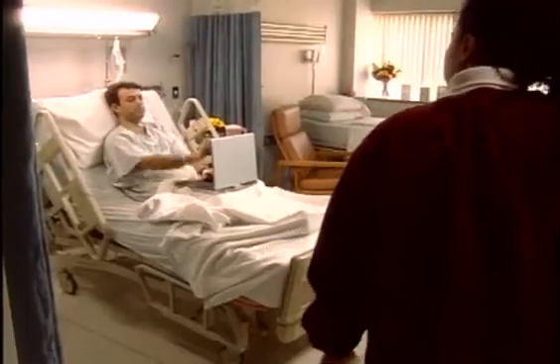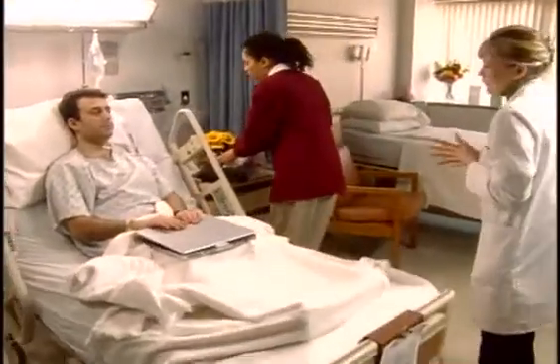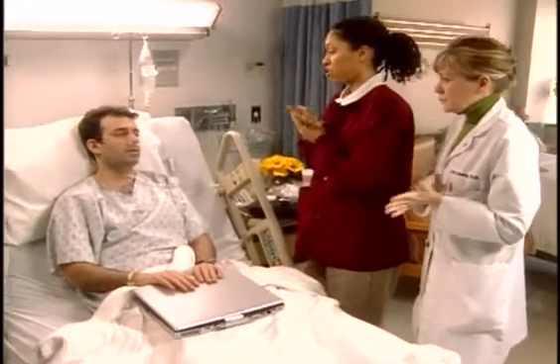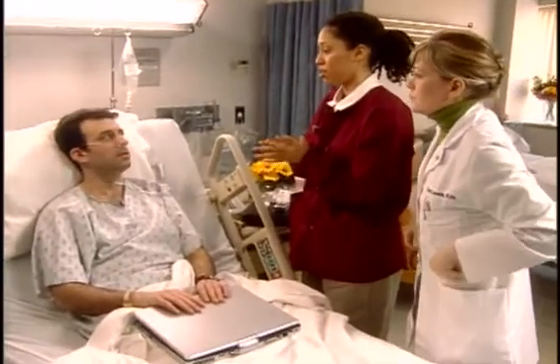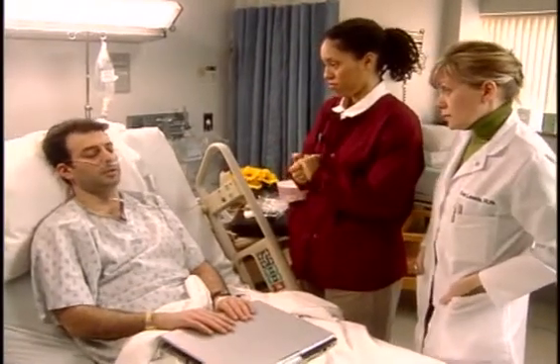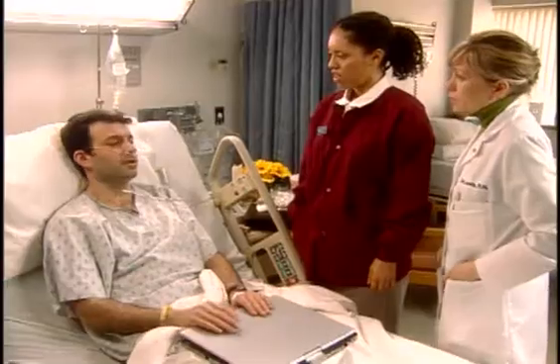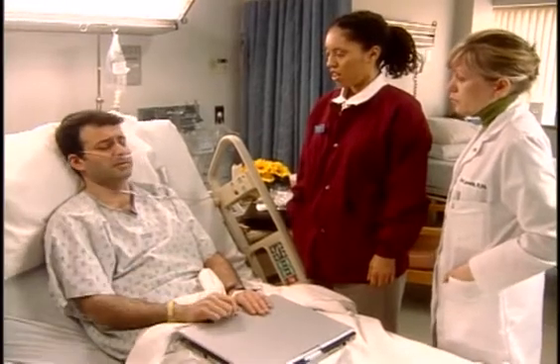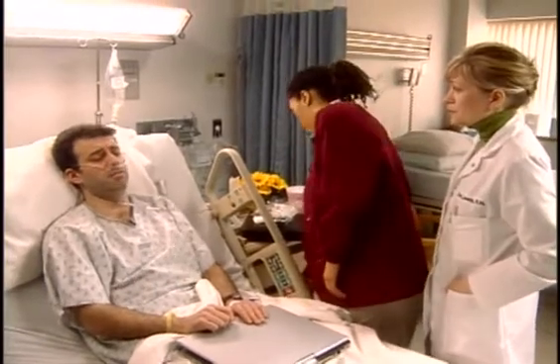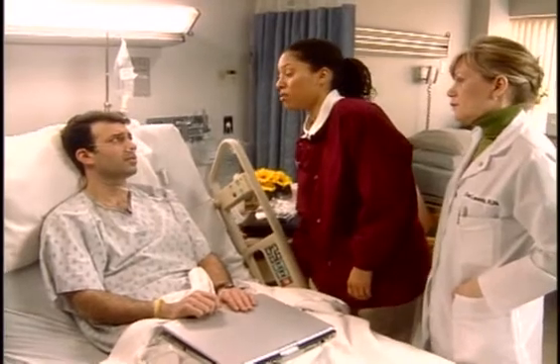Hi, Mr. Simon. This is my nursing instructor, Miss Lewis. Hi. Your doctor wants us to change the way we're giving you oxygen, so I'm going to put a face mask on you, and this is going to give you more oxygen and help you breathe easier. Okay? Listen, there's no way I can use a phone, is there? Excuse me? Call my office. Look, I've been here a lot longer than I expected, and I'm missing a meeting. Is there someone here who can set me up on a conference call? Mr. Simon, think about how you feel right now. It's really important that we raise your oxygen level, and the mask will help accomplish that.